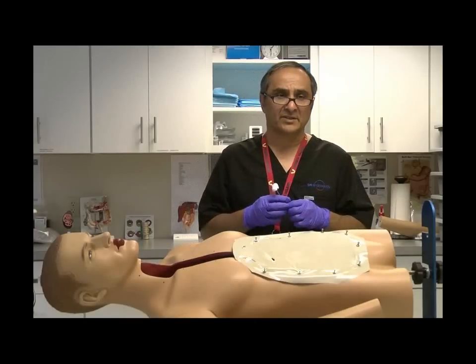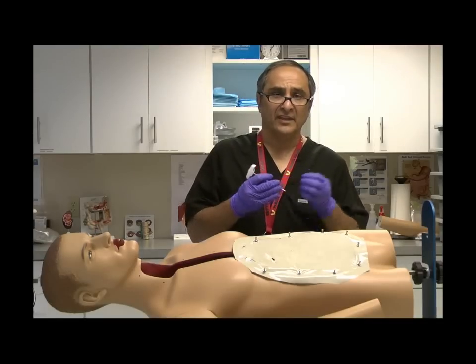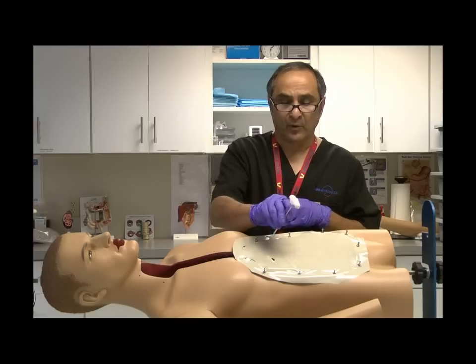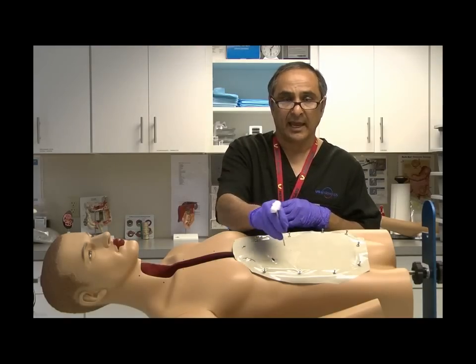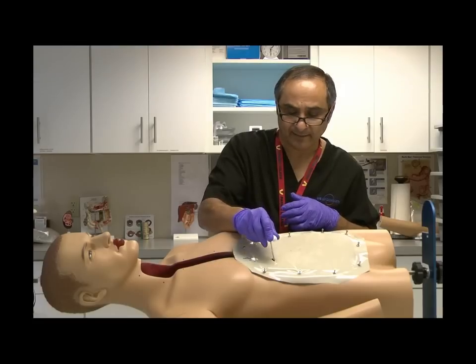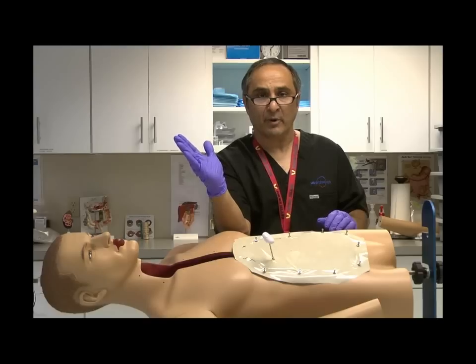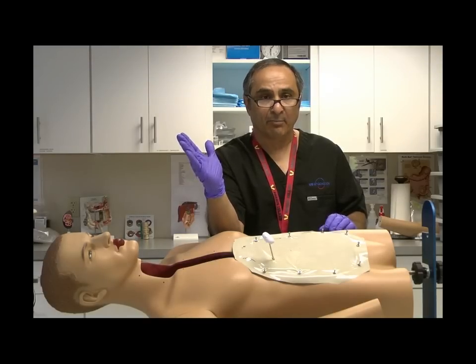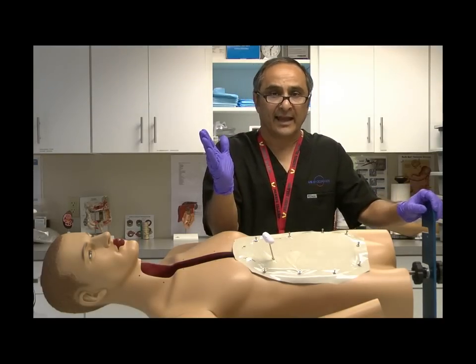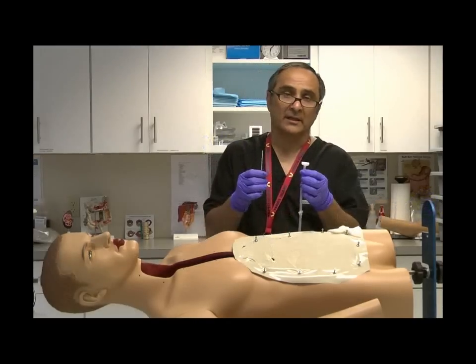One of the critical elements prior to placement of the actual device is to determine the direction or angle of the well-established stomal tract. In other words, we need to find out which way the angle of the tract is. And to do that, simply lubricate the tip of the obturator, place it into the tract gently, and see how it falls and see which direction it falls. As you can see here, it's falling to my right, or it would be your left. It's important for the clinician to make a mental note of that direction and apply that direction while installing the new non-balloon replacement device. So, let's get started.